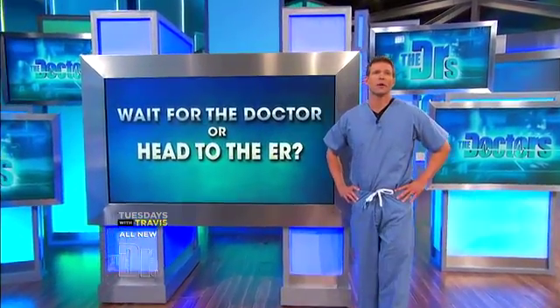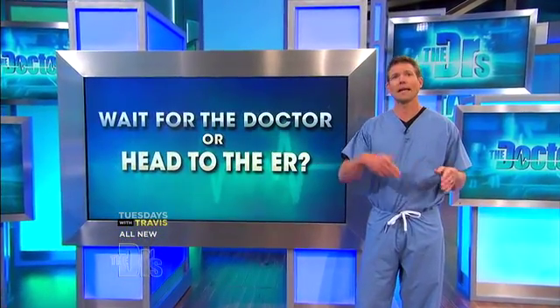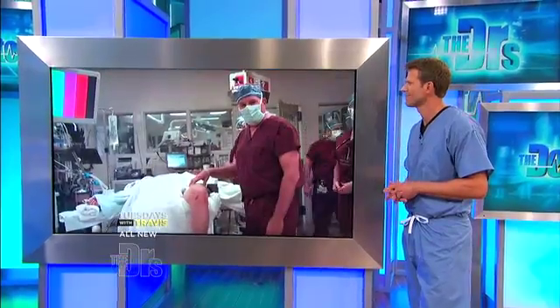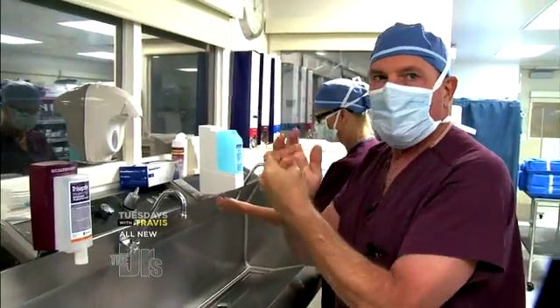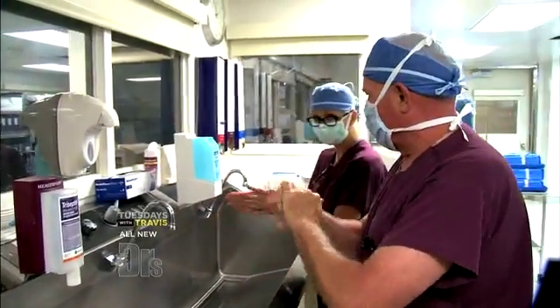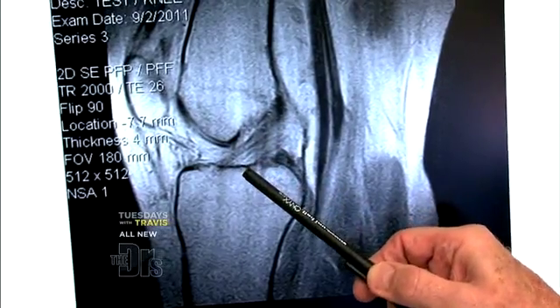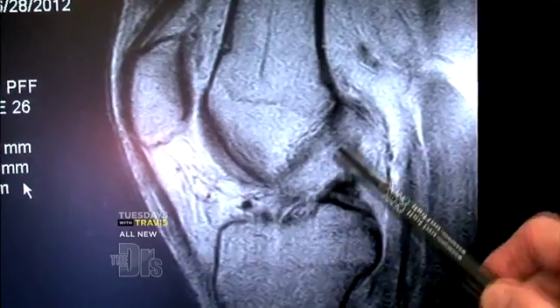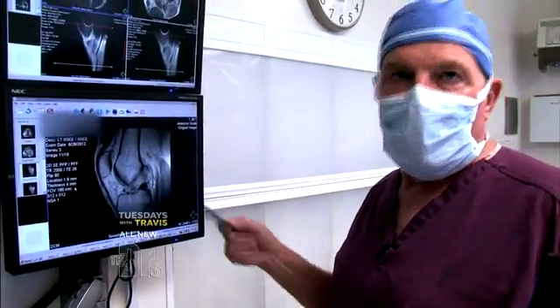We sent our cameras into Cody's surgery to see how an ACL and LCL are repaired. Today we're doing a reconstruction of the ACL and the LCL, two of the main stabilizing ligaments in the knee joint. Here's the normal ACL. Cody doesn't show any of those fibers, so in this setting it's what you don't see that tells you the ACL is torn.